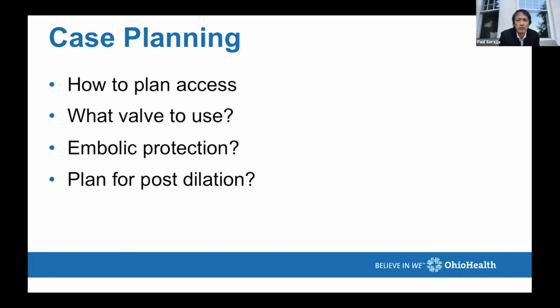Yeah. So we did a similar case like this. We just did peripheral IVUS. Peripheral IVUS works really well, and then for sizing we did 3D TE for the preliminary, and it worked quite well too. And when you're going to do a valve-in-valve, you probably don't have to use any dye. One thing you can do is just do one shot of the leg that you cannulated and go.